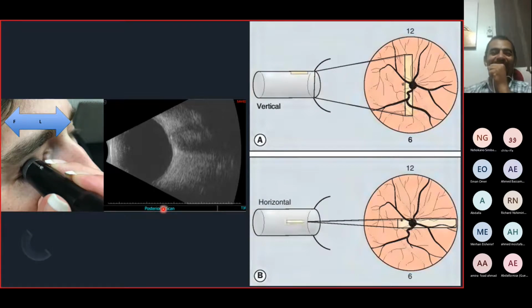Okay, so if it's an A scan ultrasound, you find that there is a vector here. A scan is good to measure the axial length and to measure the reflectivity. But B scan is good to give some idea about the morphology. We should know that if there is a mass, for example, a tumor or something like this, we need to scan in 2 directions at least.